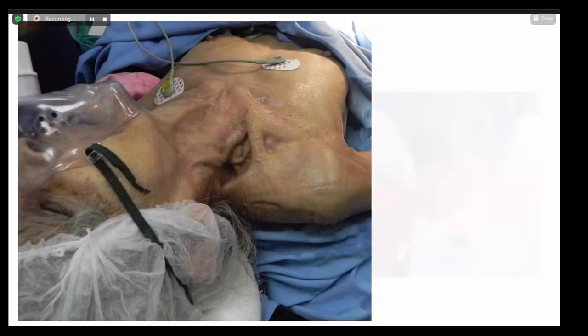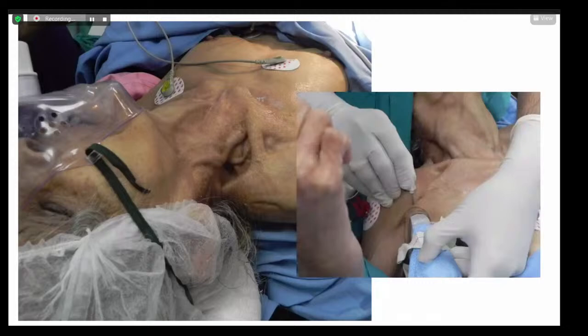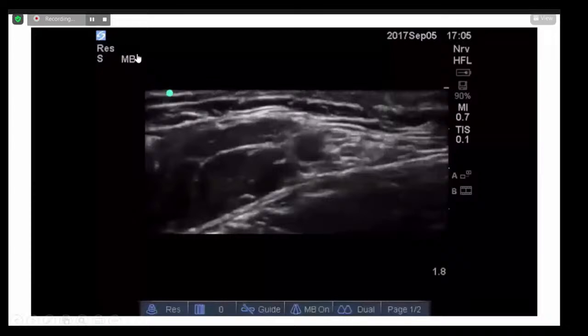So I think, Sandeep, something like this. Yeah, correct. So this is what exactly we did in this case. Surjit, this is a sort of supra-axillary, what we mentioned. We mentioned it as axillary fossa, but we give it with ultrasound. Okay, sir. Thank you, sir. So this is what we did.